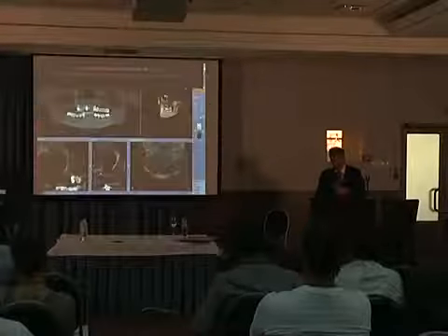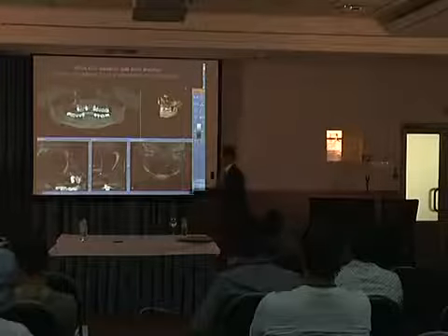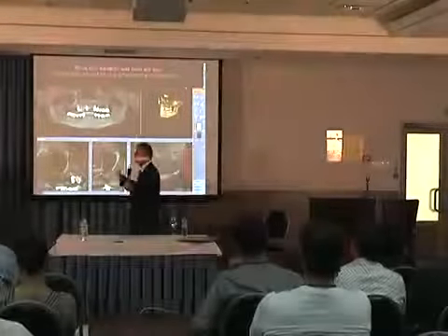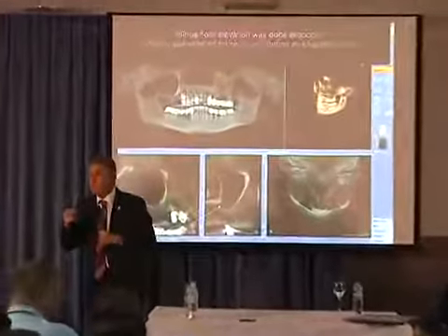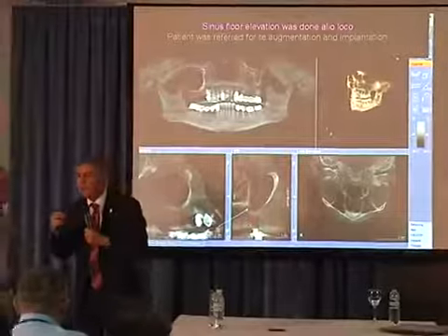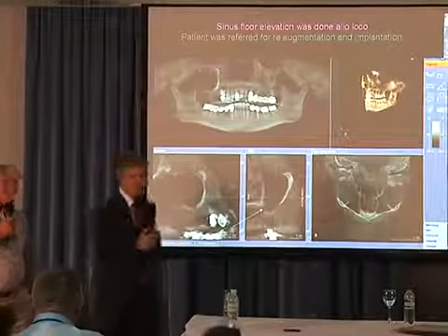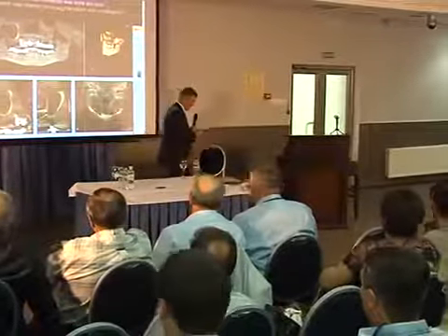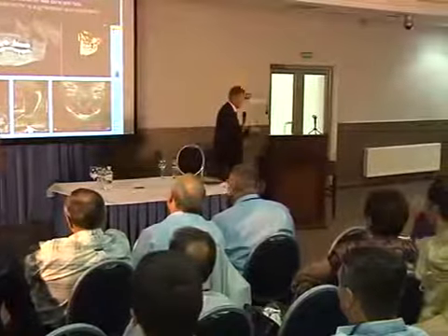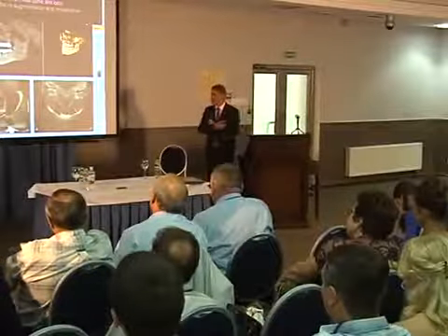Easy, yeah? Yes. Okay. The last case. Последний клинический случай. This patient was referred to us. Fred, place implant and just a little bit augmentation. I did some sinus augmentation before. Обратился пациент к доктору и говорит: Фред, пожалуйста, мне нужен имплантат, но только совсем немножко наращивания, аугментации, потому что я уже делал один раз наращивание.